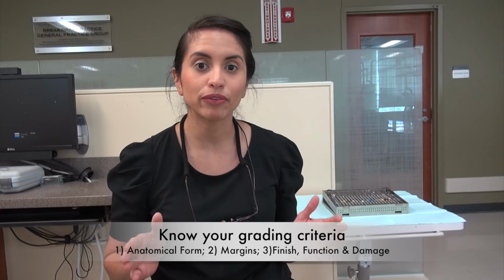One of the key aspects is going to be positioning that you have to get used to. The other thing to keep in mind throughout this video is that the criteria you're going to be graded on are anatomical form, margins, as well as finish, function, and damage. Now, the last one is really going to take into consideration how much attention to detail you took throughout the prep, making sure that you didn't damage the tooth structure on top by scraping too hard. Very easy to do. Keep in mind that you're working with a soft plastic.